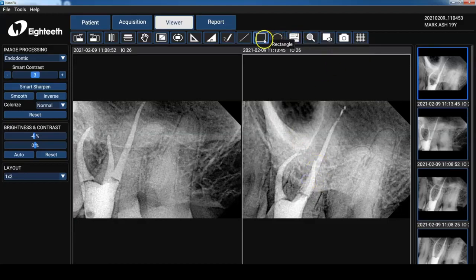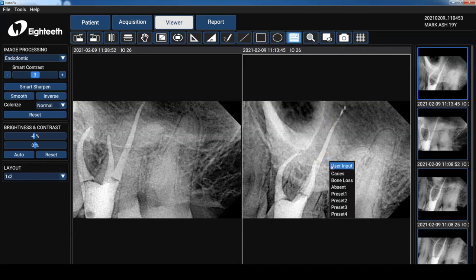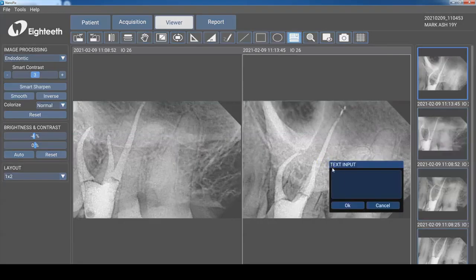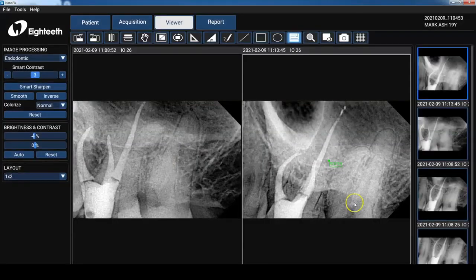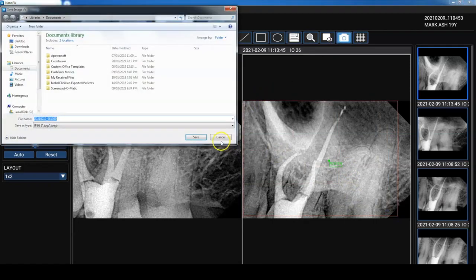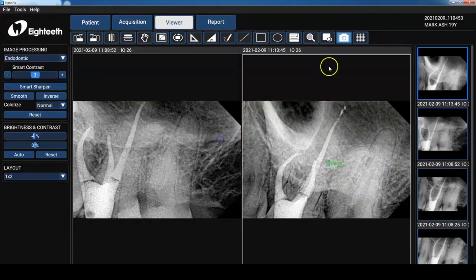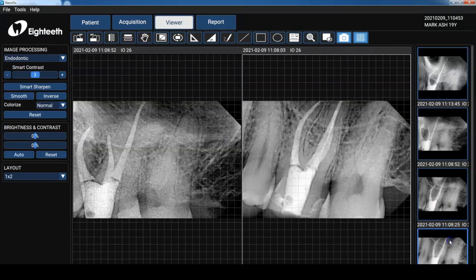You can place a rectangle, ellipse, drawing and one of the other tools you can use is just placing notes. So place a memo onto the image just to place some notes. I'm going to put in, we're going to follow up in six months. So we can clear that off or leave it. We can take an image and send that JPEG, email it or save it and then finally can place a grid. Now don't forget you can any of the images in the panel on the right you can double click and up they come.